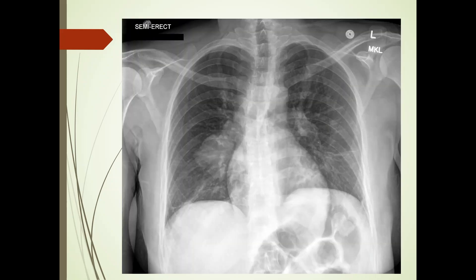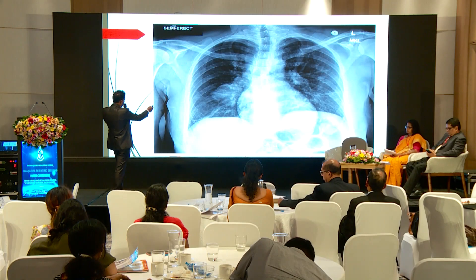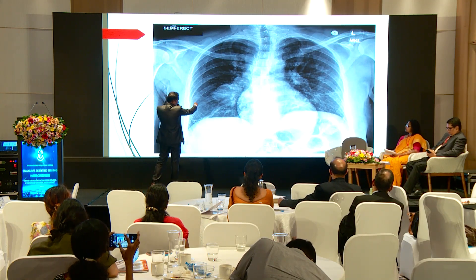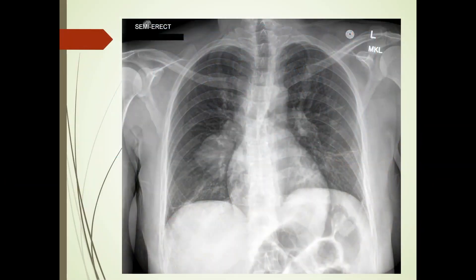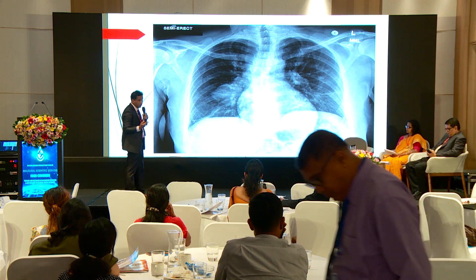The third case is a fairly straightforward X-ray. Lung apices are normal, retrocardiac region is fairly normal, but there is obvious nodular or lobulated mass in the right hilar region, and subtle density in the left hilar region as well — bilateral hilar adenopathy, right more than left. The differential diagnosis may include lymphoma, metastasis, or infection like TB. Most importantly, we don't need a histological diagnosis; we have to identify the abnormality so we can proceed with further imaging and relevant referral.